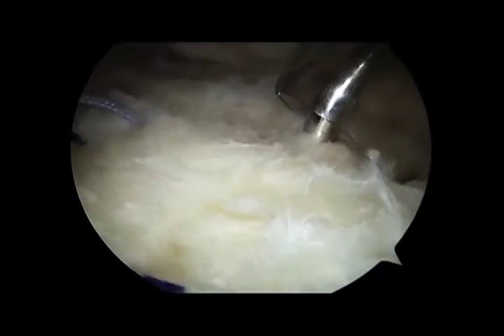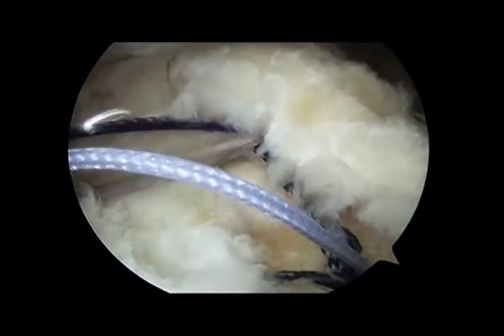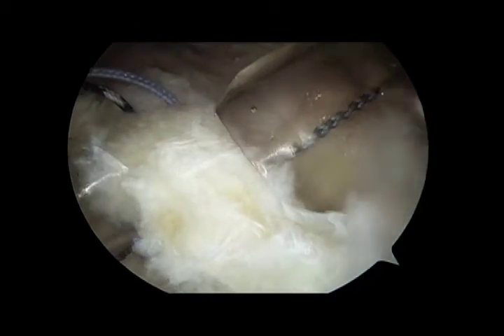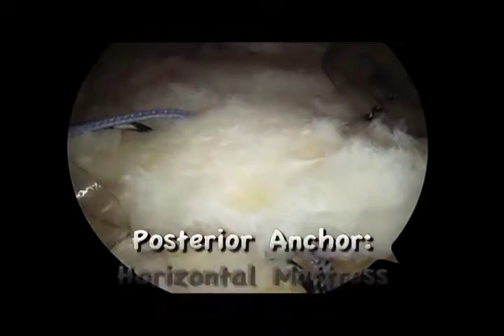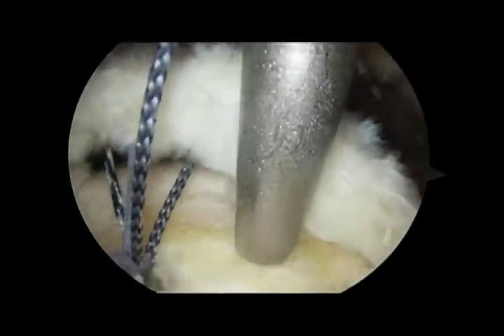The PDS is then used to shuttle the medial limb of the anterior suture back through the cuff and out the anterior cannula. It is of note that the partner limb remains outside the skin. At this point, all sutures from the posterior anchor have been passed, with the posterior suture passed in a horizontal mattress configuration, and both middle and anterior sutures passed in a simple configuration.